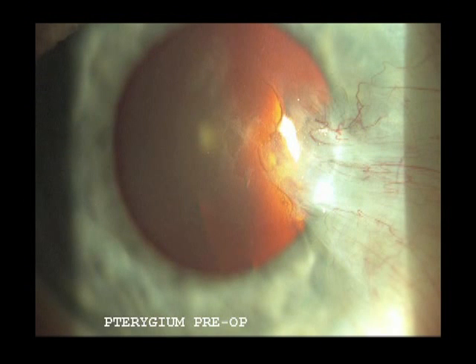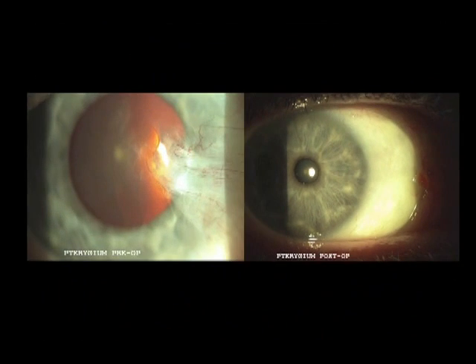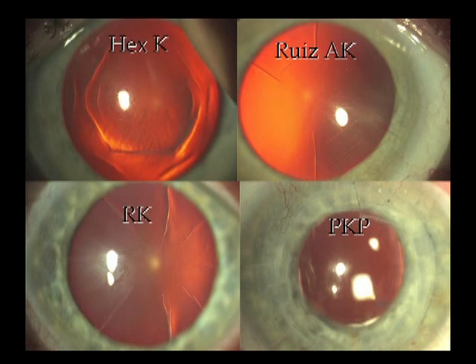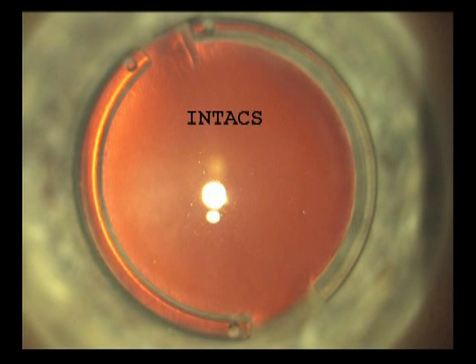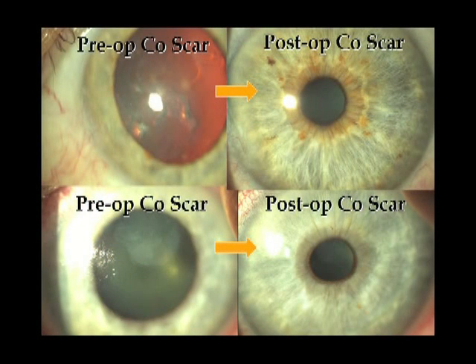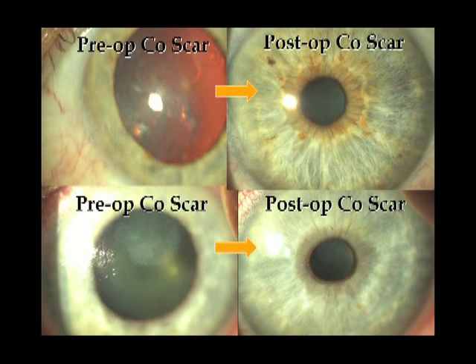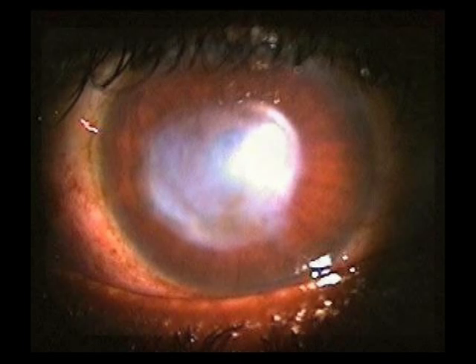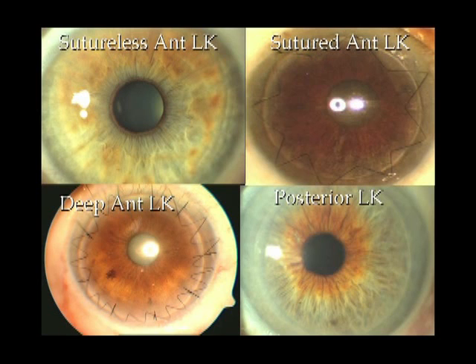For example, in ocular surface pathologies like advanced pterygium, sutureless amniotic graft can be used for excellent clinical and visual outcomes. In conditions of shape anomalies following previous refractive surgeries, laser ablation can be performed for excellent emetropic outcomes. Extreme shape anomalies like keratoconus can be stabilized using INTACS. Conditions of superficial scarring can be peeled right under the excimer laser with simultaneous refractive ablation. In conditions of deeper scarring with involvement of strength and visual compromise, lamellar techniques may be used to remove the scar, build the cornea, and improve strength for future laser surgery.